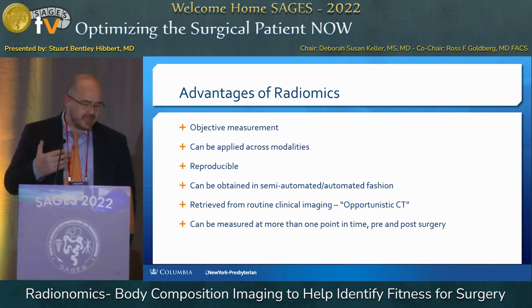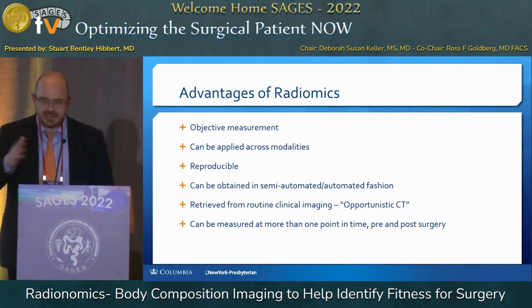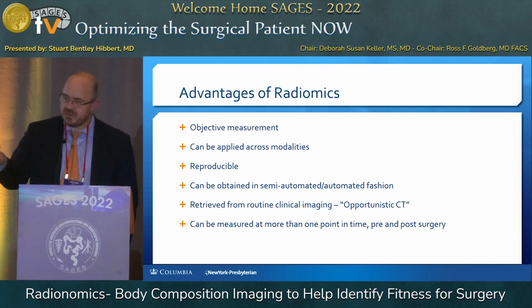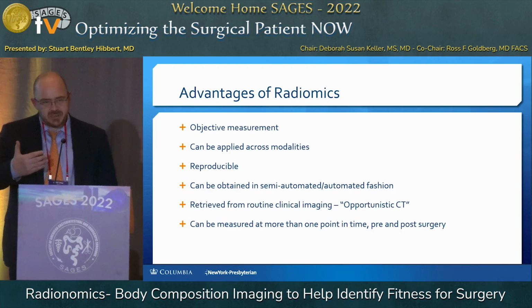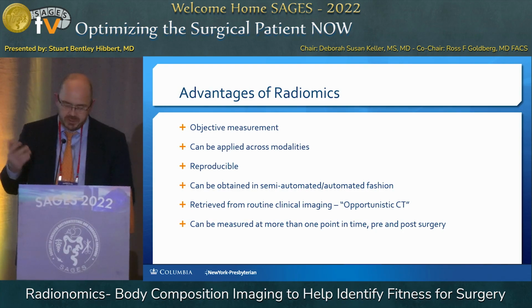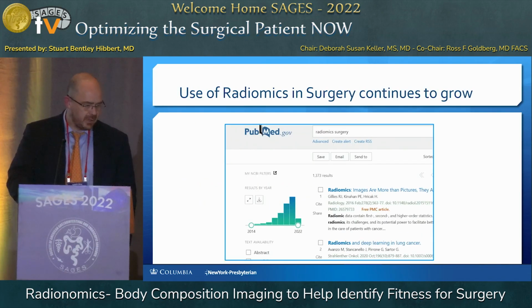So they've coined the phrase opportunistic CT. The CT is already done. Your patient's coming to see you, they're getting the surgery, no worries, we can use that data. And we can follow the patient. If the patient's being scanned for whatever reason, at any time we can extract that data. So we can look at pre-surgical, post-surgical at any point.